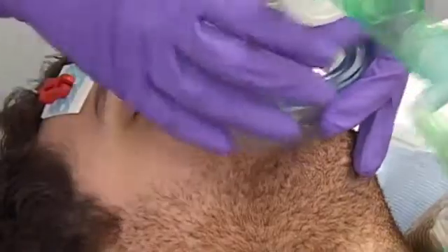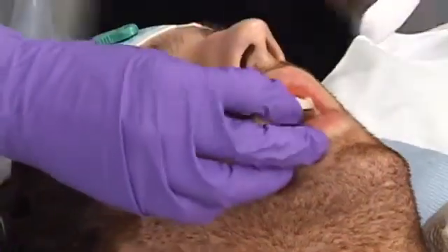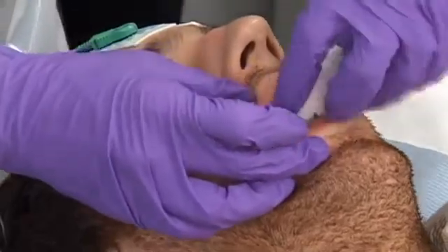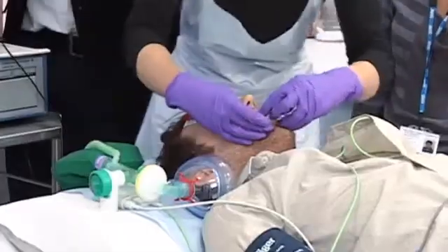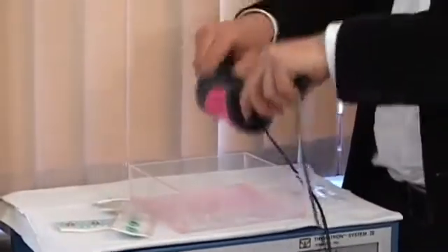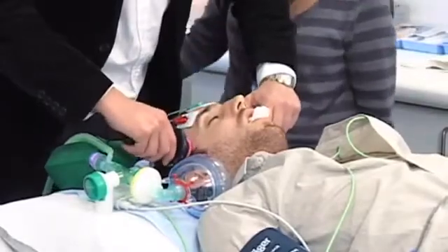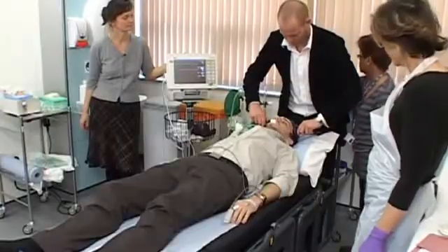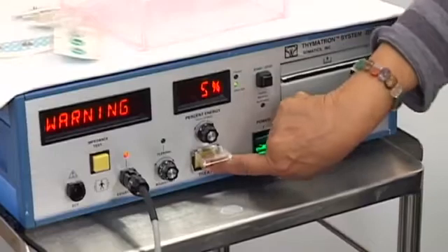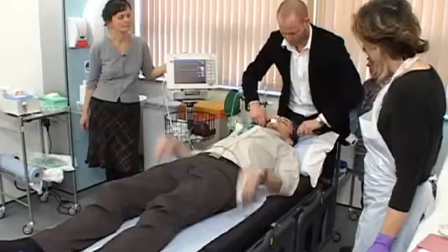The patient is given more oxygen to breathe and a mouthguard is inserted to protect their teeth during the seizure. Once under the anaesthetic, a psychiatric doctor trained in ECT will apply 2 electrodes to the patient's scalp for a few seconds. The electrodes pass a small electrical charge through the brain, inducing generalised seizure activity. The seizure is briefer than spontaneous seizures, typically lasting 15 to 45 seconds.